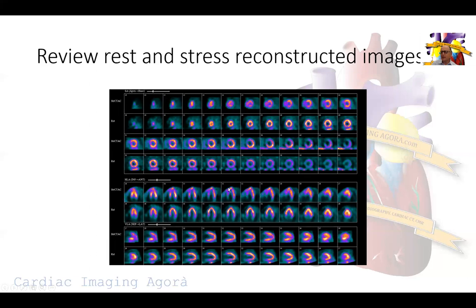These are the same images after applying attenuation correction. You can see the attenuation correction helped a little bit in resolving some of these so-called perfusion defects or decreased counts at the base of the heart, preserving the counts at the apex. However we still have a perfusion defect involving the septum, visible in the horizontal long axis, the short axis, and the vertical axis towards the inferior septum.